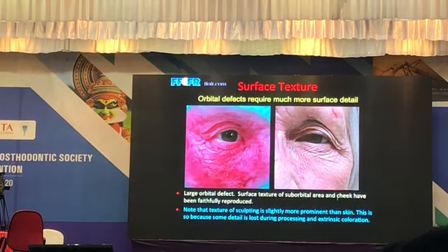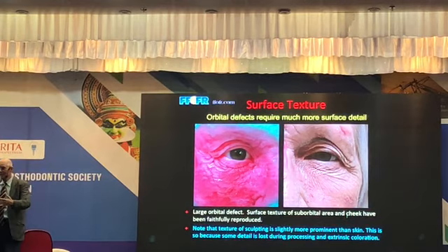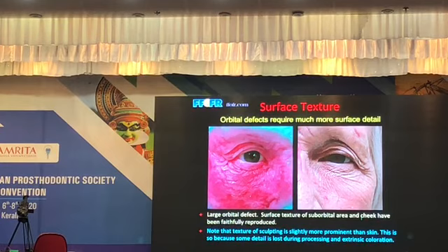Then I showed you this slide before. That's all about surface texture, isn't it? And you have to make the surface texture much more prominent in the wax than it is in the skin, because as I said before, you lose some of the detail when you apply the extrinsic coloration.